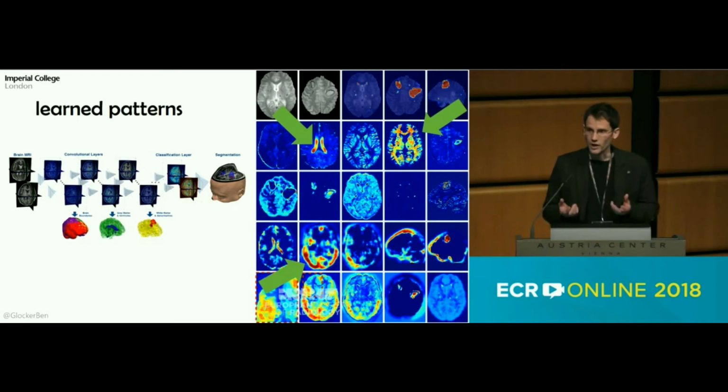The lower path was doing what we expected. It basically learned location. So it learned whether you are in the back of the brain or at the top part. So now this is interesting that those features are learned automatically. So you only give it an image and a lesion map, and the network does seem to do something sensible. Not all of those feature maps are interpretable. Unfortunately, 95% of them, if you look at them, you have no idea what they mean.